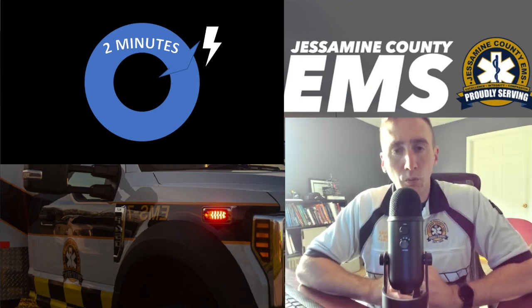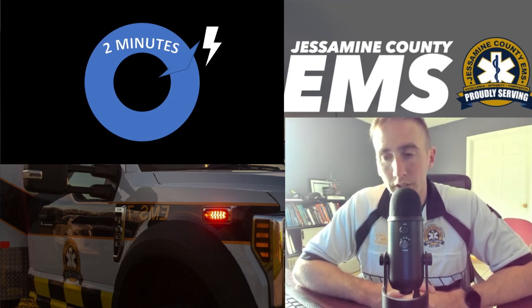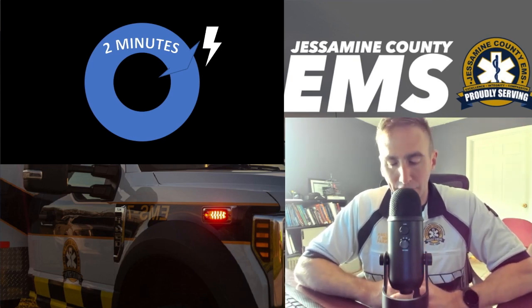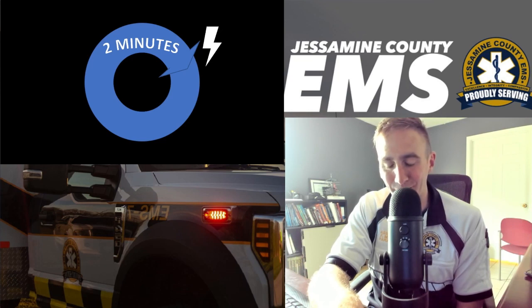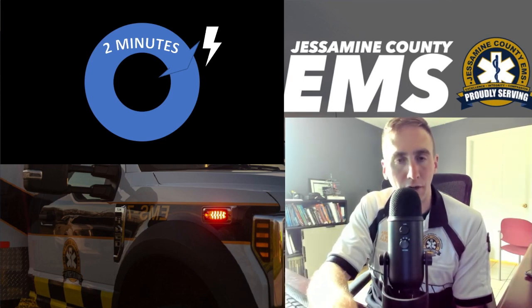So traditionally, what do we do if the patient's in refractory ventricular fibrillation? We have the initial shock, and then in 2 minutes, we shock again, and then in 2 more minutes, we shock again. And then we might change the vector up a little bit. And if that doesn't work, we just stick with it, and we don't do anything else. For some of our patients, this has not been working. We've been defibrillating patients at least 15 times without it working. So we need to change something instead of doing the same circular thing over and over again.